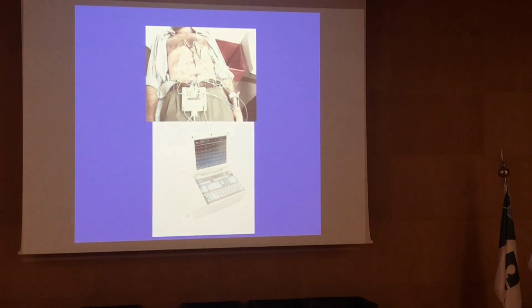So why do we need ECG? Why are we doing it, and why is it important for everybody, even a non-cardiologist, to know the ECG? What is the importance of ECG? For diagnosis of what? For arrhythmia. That is number one. Why? Because if the heart rate is 150 beats per minute, we can get it by pulse oximetry. But it could be sinus tachycardia, atrial tachycardia, atrial fibrillation, or ventricular tachycardia. We know the source by looking at the ECG and its waveform.